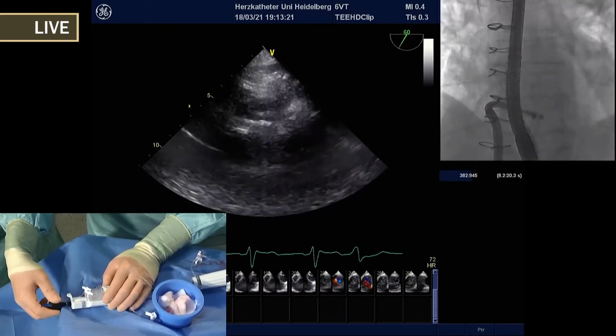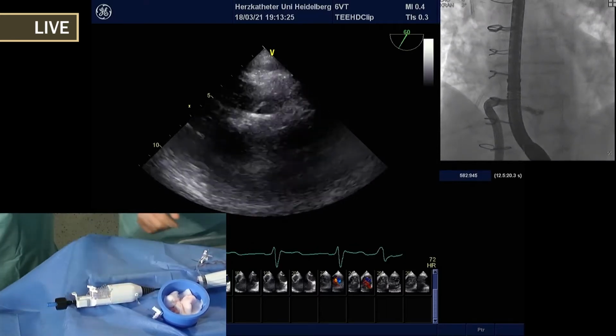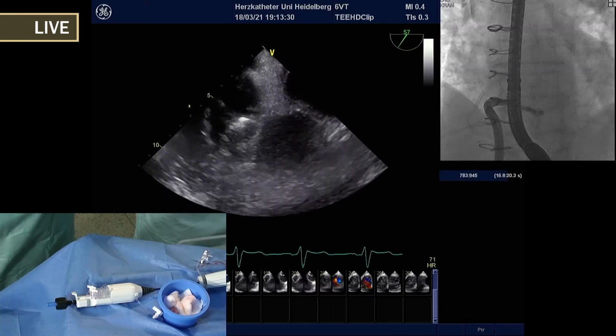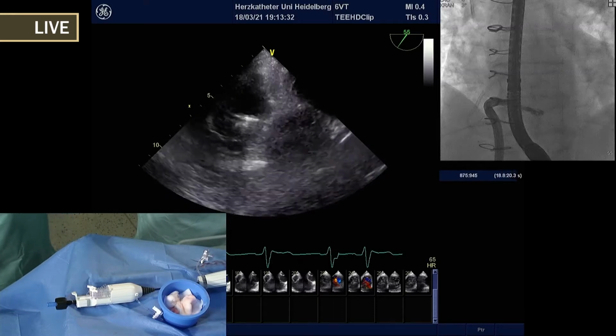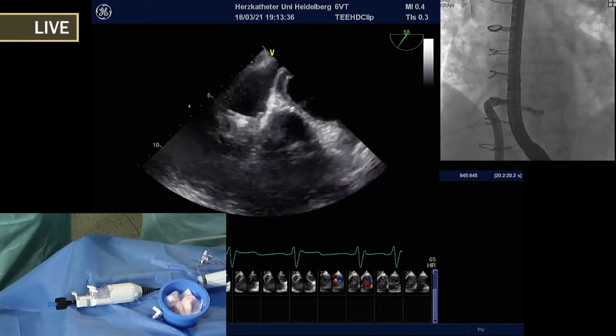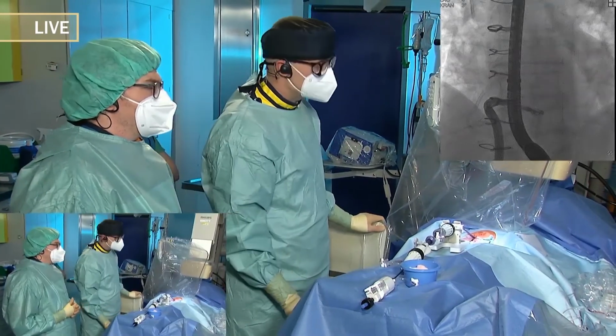Is that 180 now? Yes. Yeah. So sometimes on the mitral side, you can see the clasps when you have good leaflet insertion. You can see the clasps lifting a little bit. In tricuspid, you don't always see that. So we can try if we can see that in this case.